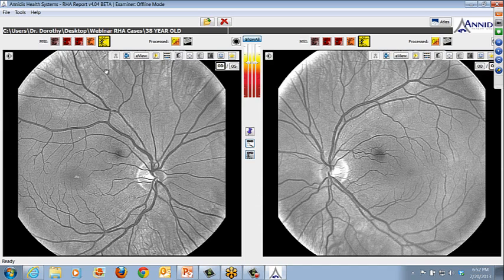So this is more of a traditional view, and it's quite a bit harder to see that there's anything wrong in this 38-year-old. You can certainly see that he has a blonde fundus. Just looking here, you can actually see the choroidal vasculature and see that in fact he has very low pigment reserves throughout his retina by makeup.